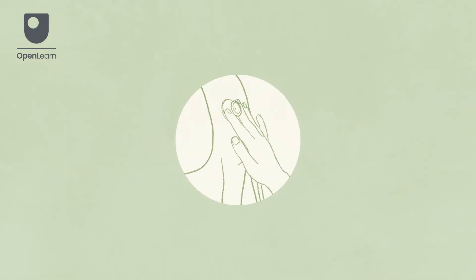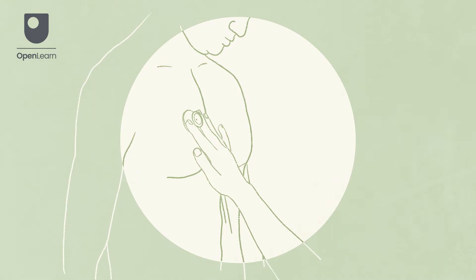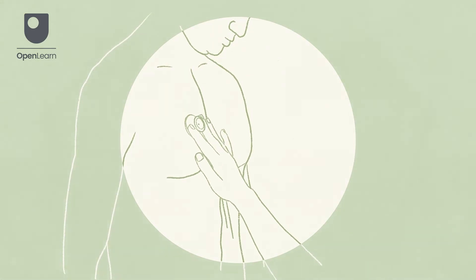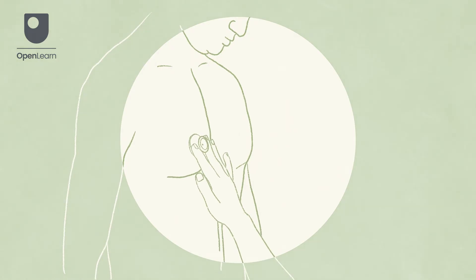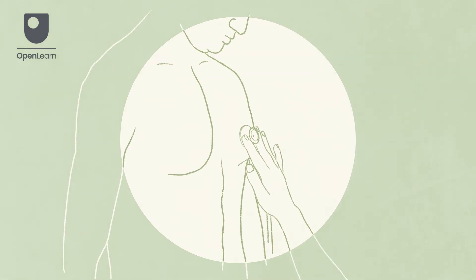While in each position in the stepladder, pause for inspiration and expiration, listening for normal breath sounds. Take note of any abnormal sounds; common examples include crackles, wheezing and stridor.